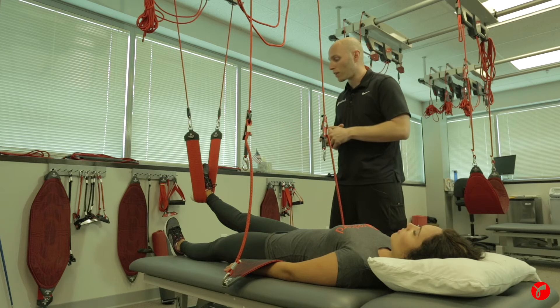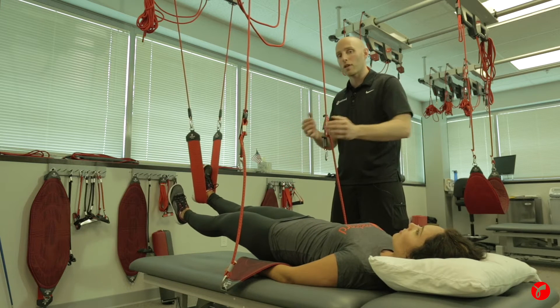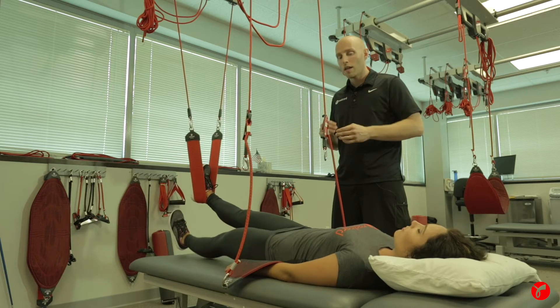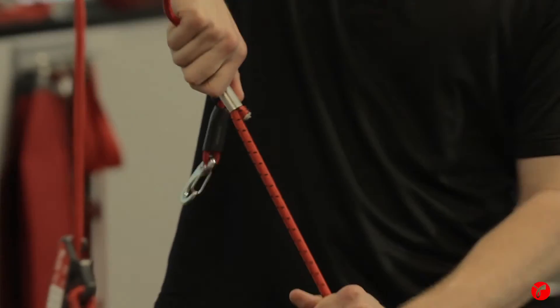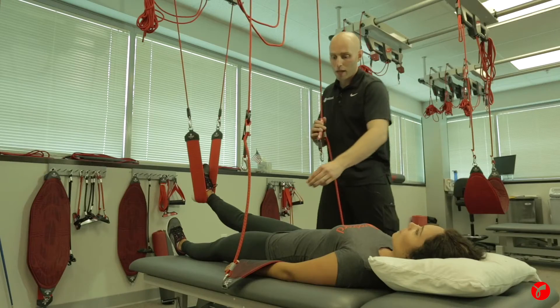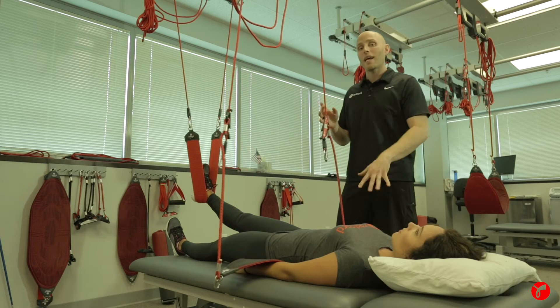For instance, if Dani were to go into a supine plank and either her pelvis is dropping or she's in pain, what we would do is take the bungees — which you can see here — they have this elastic component to them. They are attached to the static rope, and then attached to a wide sling that is supporting Dani's pelvis.